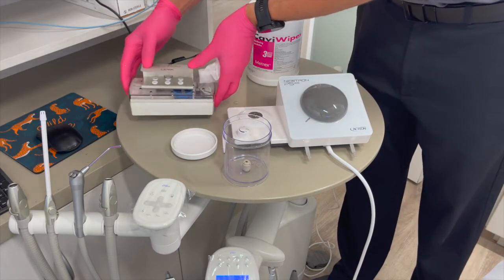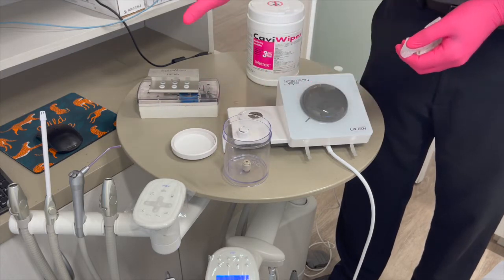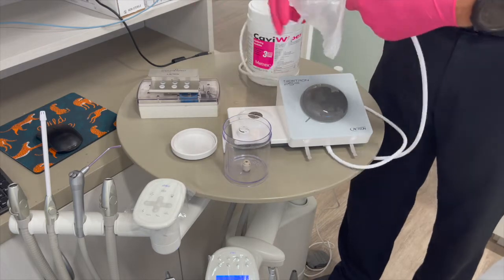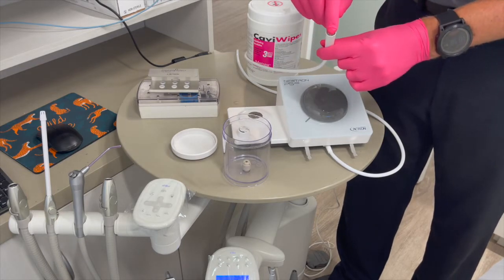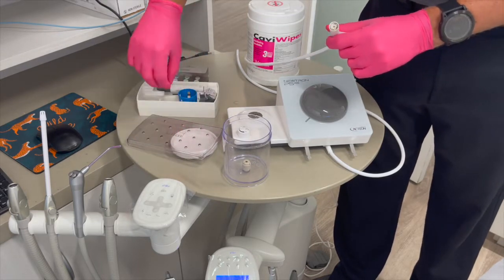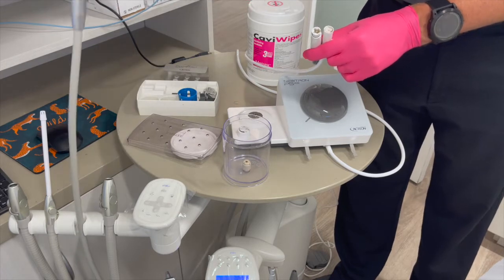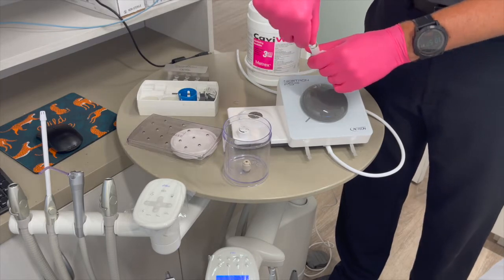Wipe down the lid and the actual vessel itself, inside and out. Leave it off to let it dry. We'll also disinfect the tube — just run your wipe along the tube. Be mindful not to get any liquids inside. If you do get liquids in the back end, take your syringe and blow it out to make sure no water accumulates in there, as it could interfere with the connections when you put them together.